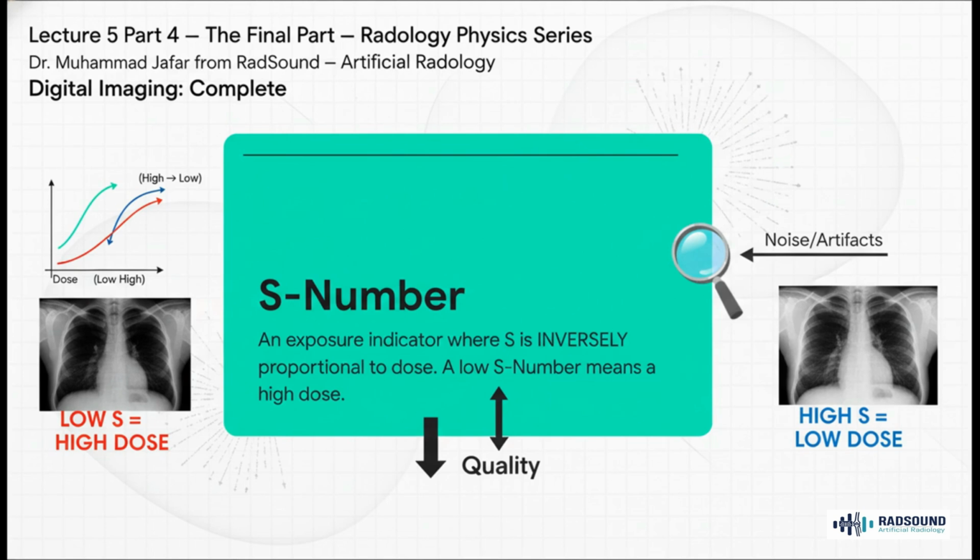Now listen up, because this is so important and completely counterintuitive. The S number is inversely proportional to the dose. A low S number, like 100, means the detector got blasted with a high dose. A high S number, like 400, means a low dose. You just have to burn that into your brain because it's the opposite of what you'd expect.